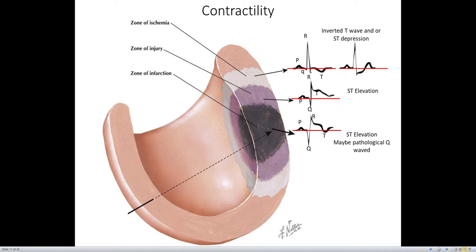If we look at the infarcted ECG complex, you can see that that ST segment is above the baseline, and that's commonly indicative of what we call injury. When you're looking at an EKG, you can't necessarily say it's infarction. We usually have to say injury pattern, because infarction is something that really has to be determined via an echo. When you do an echo and you see akinesis, no movement, that means that there is infarcted tissue. But an EKG is not that specific.